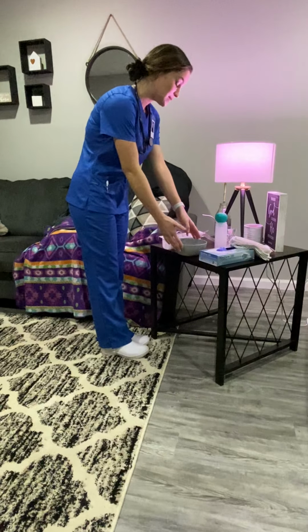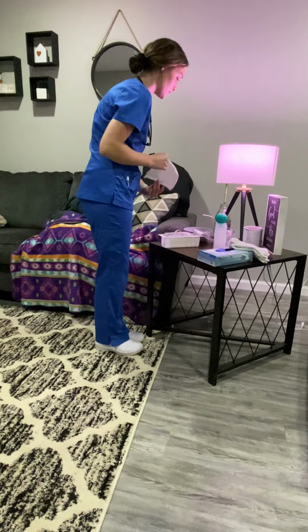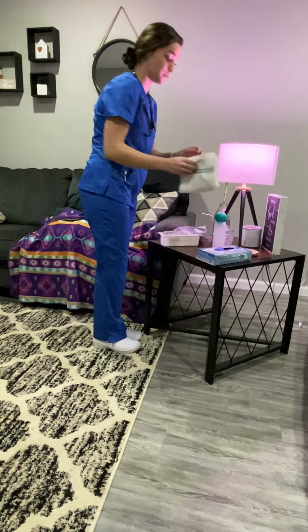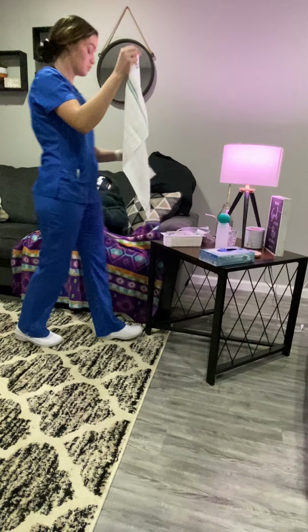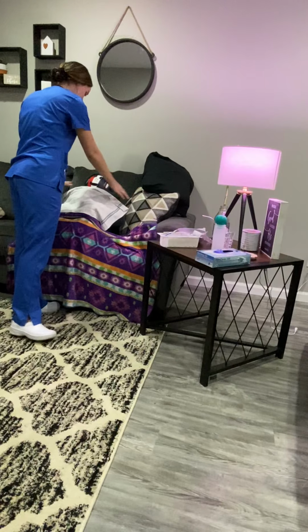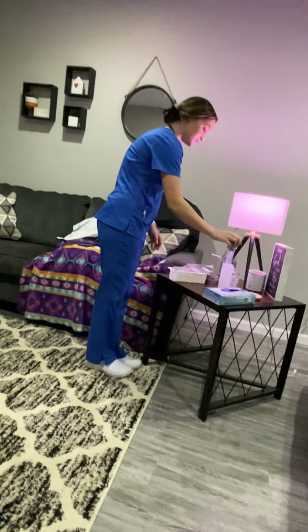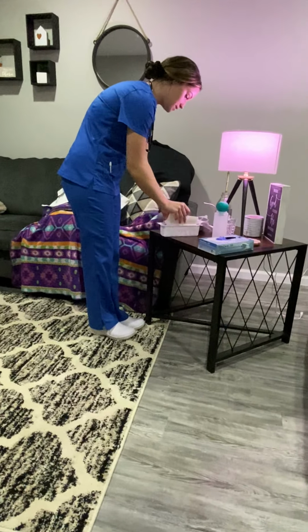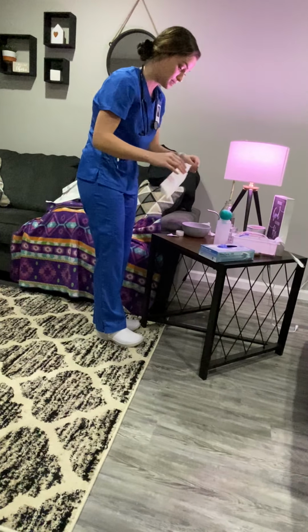So I have my basin for if the patient needs that. I have my tissues for the patient. And then I'll have a towel to drape over the patient so that if anything comes out of the tube, her clothing is protected and so is the bed. And then I have my syringe here. And then I've got my NG tube. I'm going to go ahead and get this open.